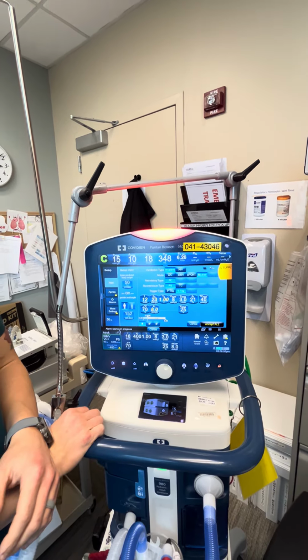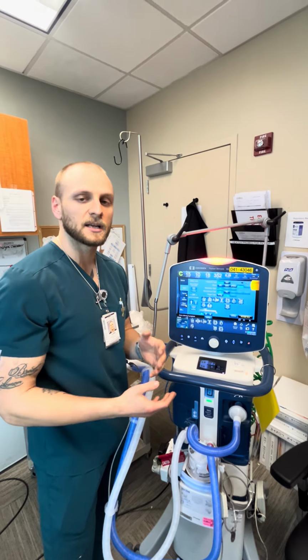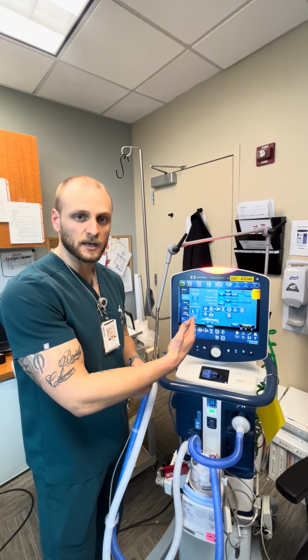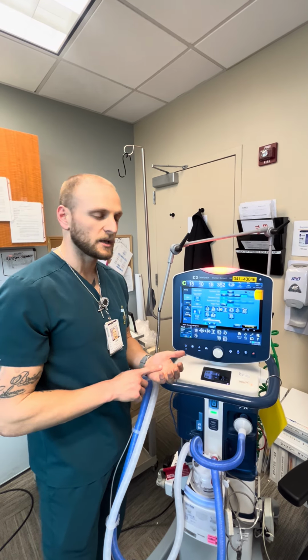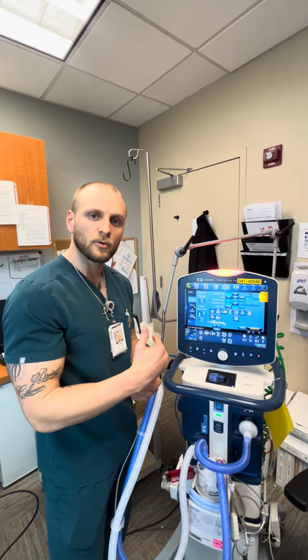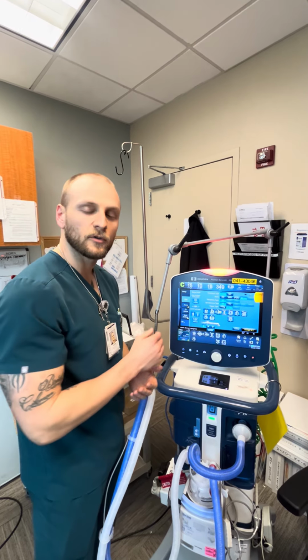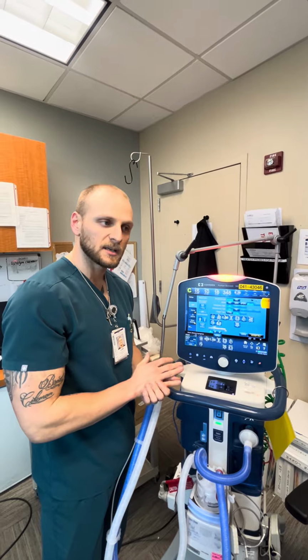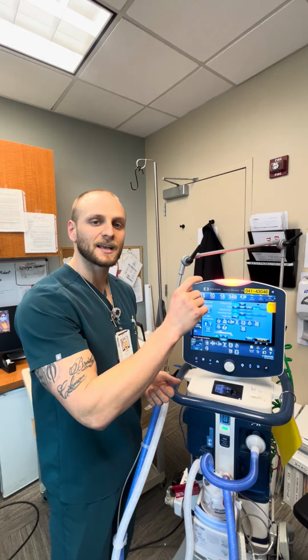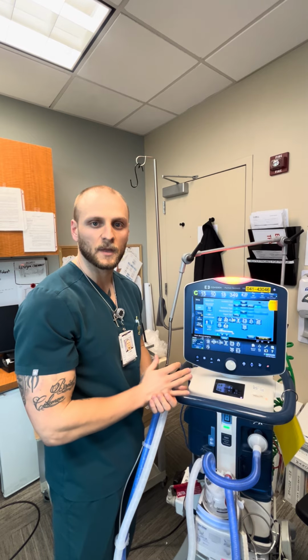Now, P high. P high is something that we're going to derive from our patient itself. It's one of those settings that we're going to need our patient to give us information so we can set our initial setting, okay? If your patient is currently on volume control, like most of our patients will, you're going to take your patient's plateau pressure. Whatever your plateau pressure is, you are going to use that exact pressure for your P high, okay? That being said, in the odd instance that your patient's on pressure control, you're going to take your set peak inspiratory pressure, your setting, and use that as your pressure high, okay?